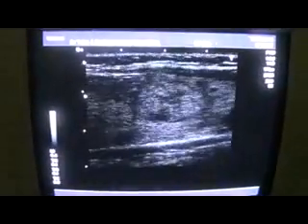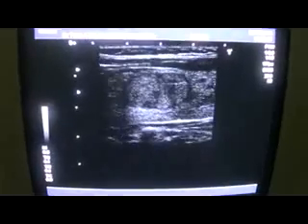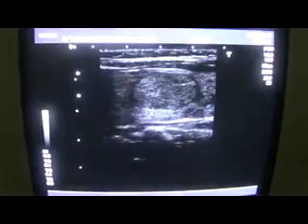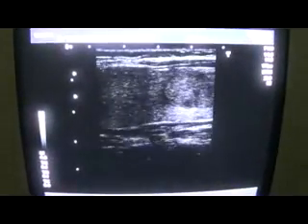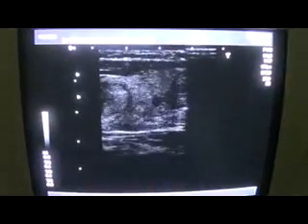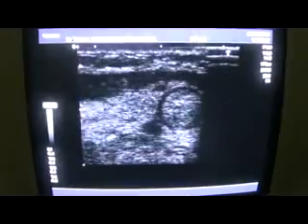If you see that this is the whole gland, total gland as we see. Right, this is the right thyroid lobe, and it's in the middle of the right thyroid gland. So now there is another satellite lesion seen, which is at the superomedial margin. This one.